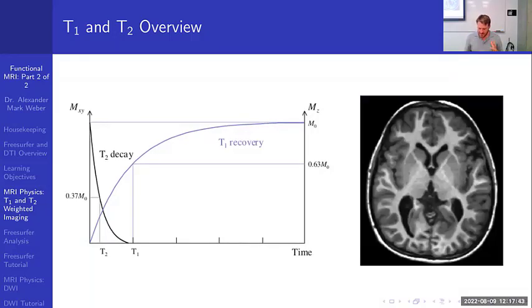T1 relaxation is the loss of this extra energy from the spin system to its surrounding environment, or the lattice, hence the spin lattice relaxation. This energy loss is unrecoverable and represents the transfer of heat, hence the origin of the T1 synonym, thermal relaxation.